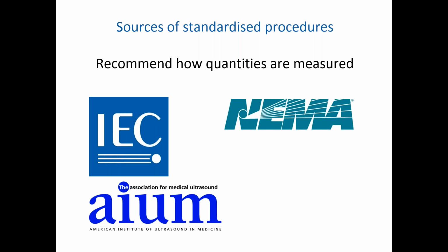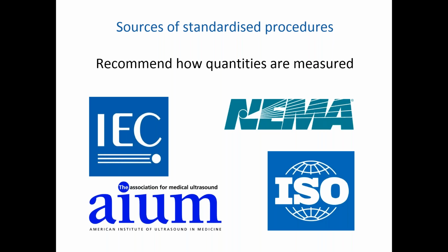It's also worth bearing in mind that because of the harmonisation work that's ongoing within the IEC, many of the stipulations of UD2 are now making their way into harmonised regulations that apply worldwide from within the IEC framework. And then also the ISO organisation, the International Standards Organisation, will have recommendations in terms of how we may be undertaking good laboratory practice.